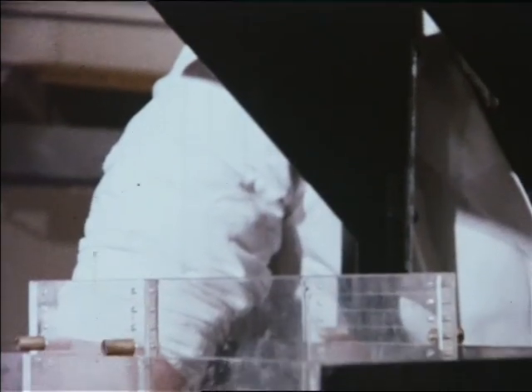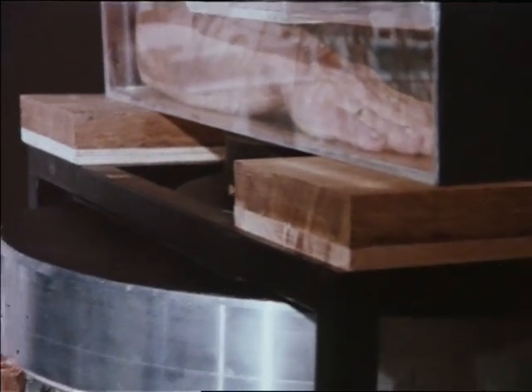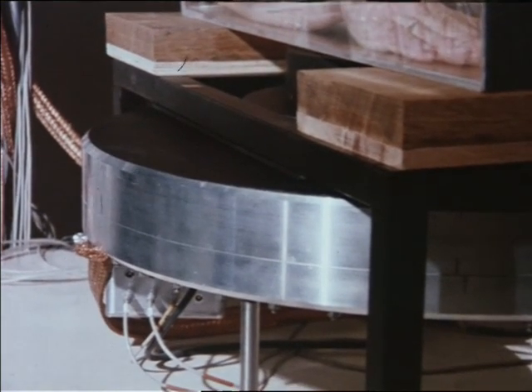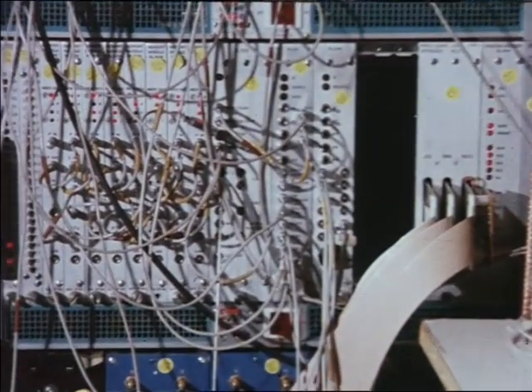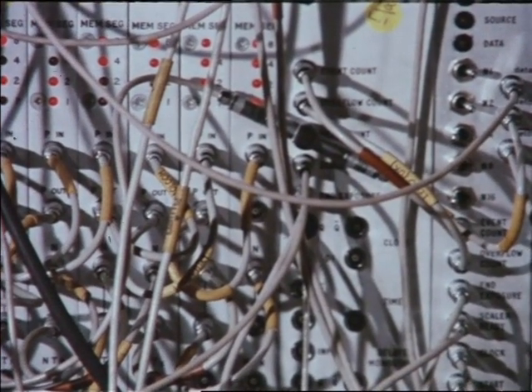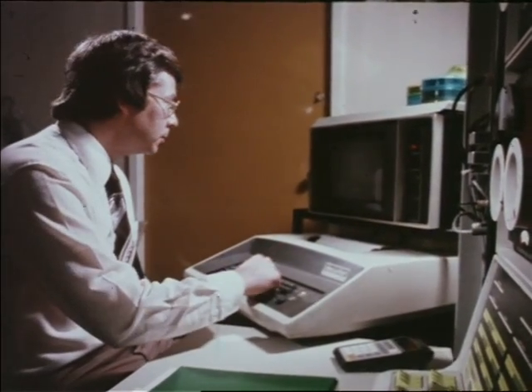During the exposure time, particles from the source pass through the subject's forearm, and instead of falling onto a photographic plate, pass into a steel chamber containing a rare gas. Here, the radiation causes minute electrical discharges which can be detected. Millions of tiny signals are passed to the computer, signals which can then be organized into an image. But it's an image from which measurements can be taken.